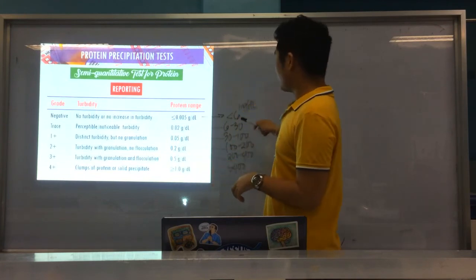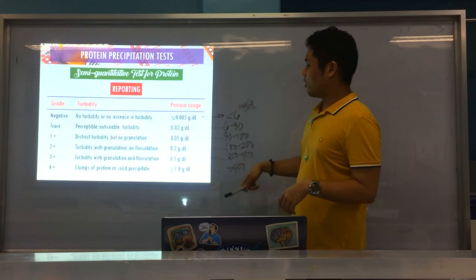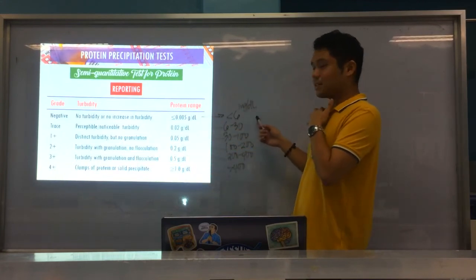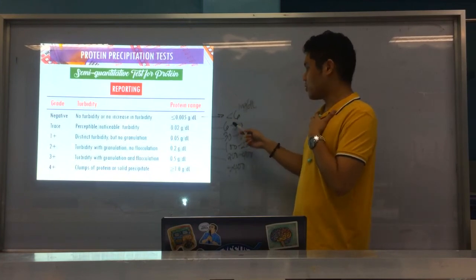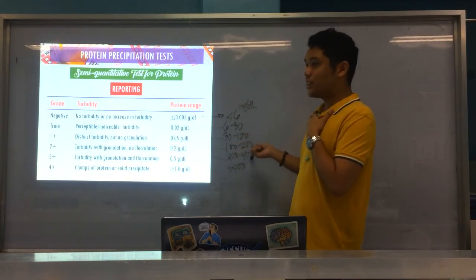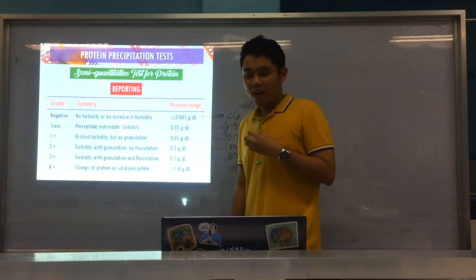Alright? And please take note of their equivalent ranges. Follow those. Alright? You could also memorize this to make it easier, but this is easier to memorize: less than 6, then the range is 6 to 30, of course, 6 to 30. So the next one starts at 30. 30 to 100. The next is 100 to 200. 200 to 400. And then, greater than 400. Okay? Alright. So that is it for SSA.